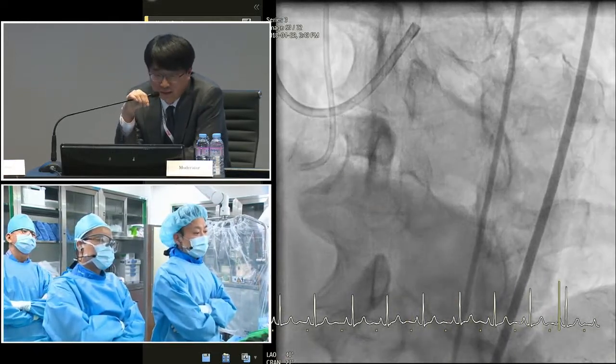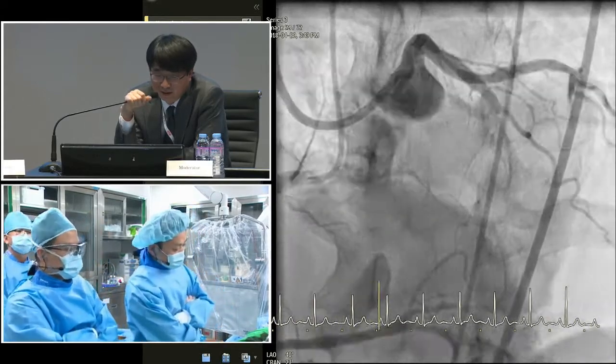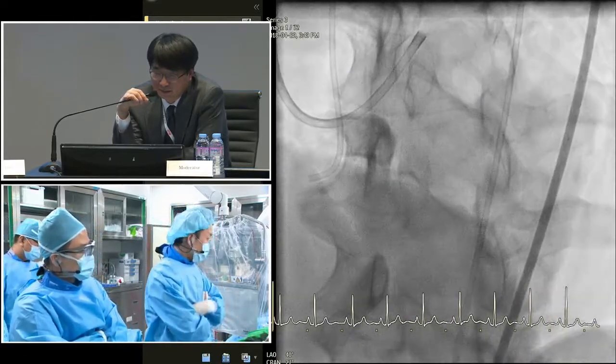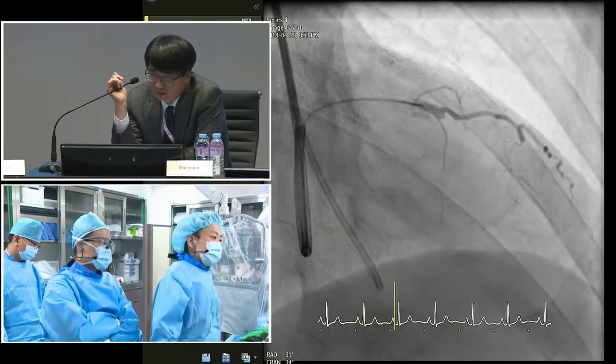What is your plan? My plan? Yeah. Of course, I studied from the integrated approach. So let me show you today's procedure until now. Next please. This is the chip injection.